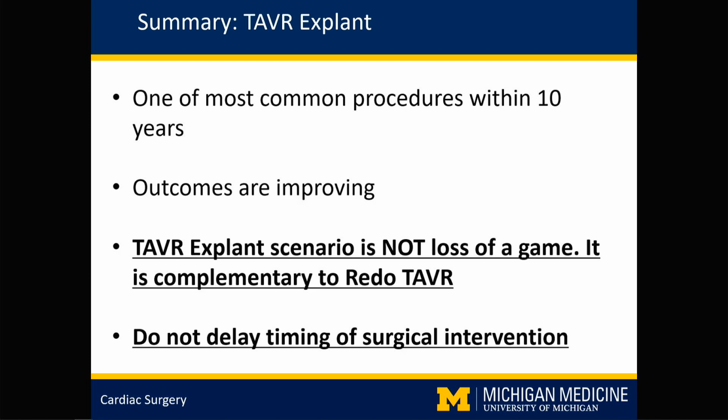Yeah. In the special issue that I shared in the slides, we shared our latest experience. Those originally high-risk patients are actually doing very well post-TAVR explant, but originally low-risk patients are the ones who are unfortunately not doing well, at least at our site.